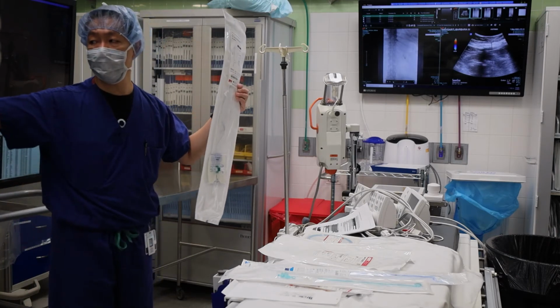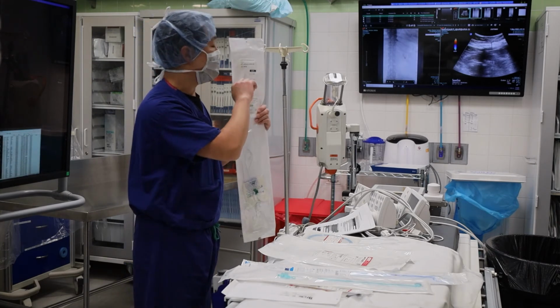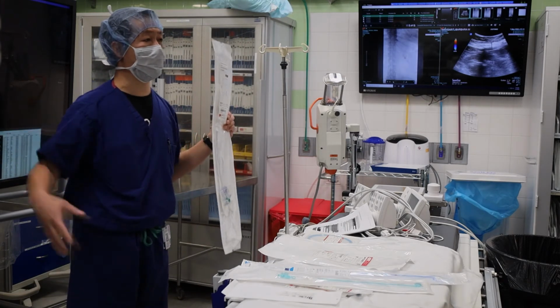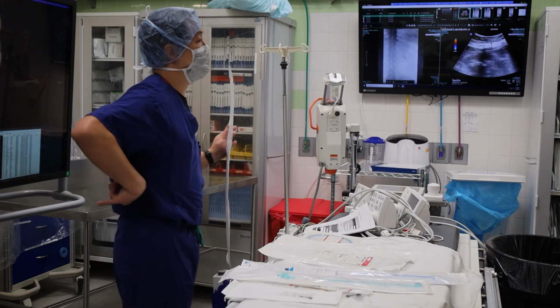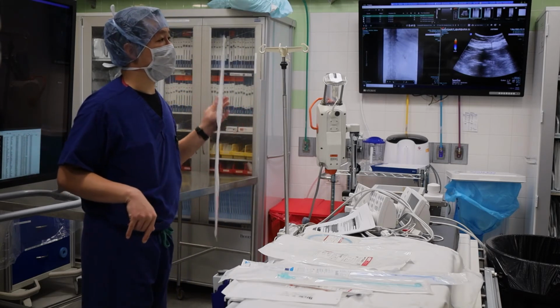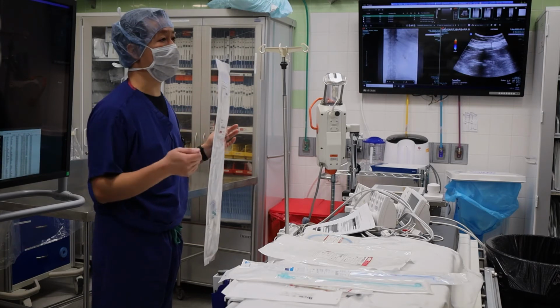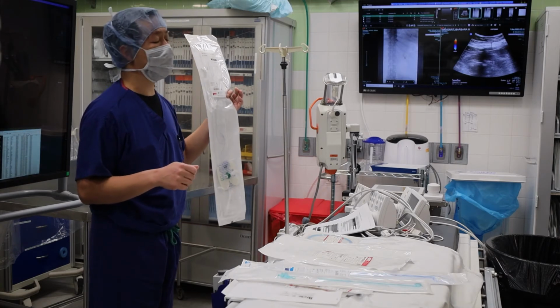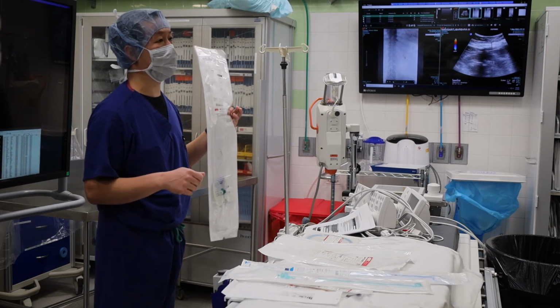But if you can cross the obstruction and go all the way down, once this tube is in, it allows you to have the option of detaching the bag, putting a cap on the inside. Now urine goes through the stent down to the bladder, just like a normal kidney on the other side, and now they pee normally. And all they'll have is a little nubbin sticking out of the back. When we put it in, sometimes we're not sure it's going to stay open, so we still put it into a bag to decompress them, and then we tell them a week later, come back and put a cap on it. These are also nice because if the person yanks it out, they've got like an extra 6 inches to yank before the whole thing actually comes out, so that's why these are nice.